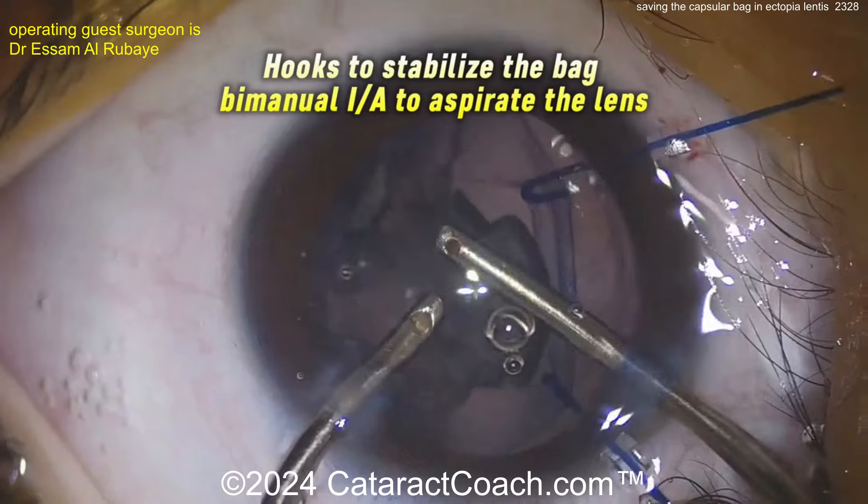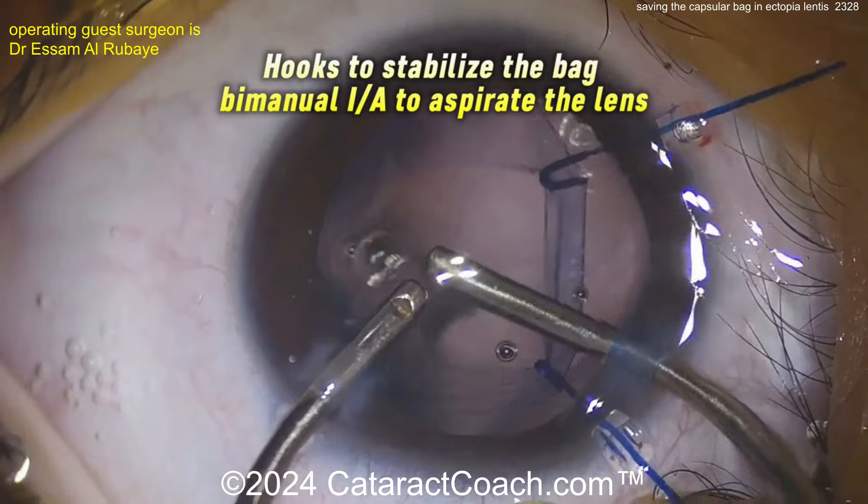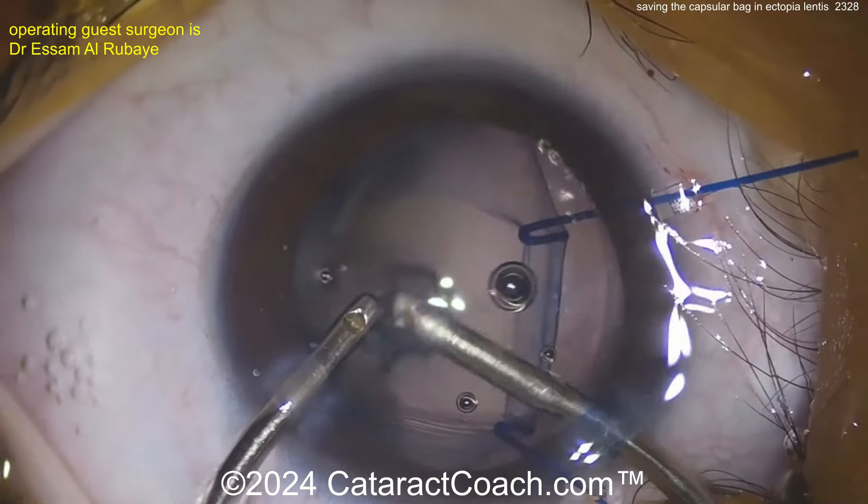Using hooks here — you can use iris hooks, which are also specialized as capsular hooks. Be careful with iris hooks: if you're not careful, those iris hooks can poke through the capsule and damage it. But fortunately, here it all looks pretty good.